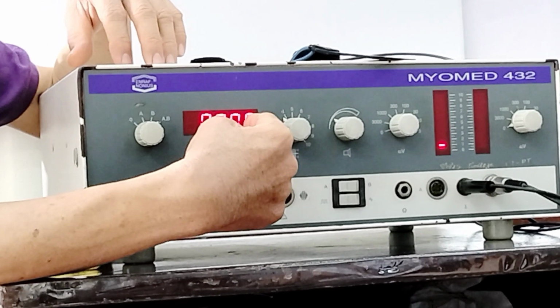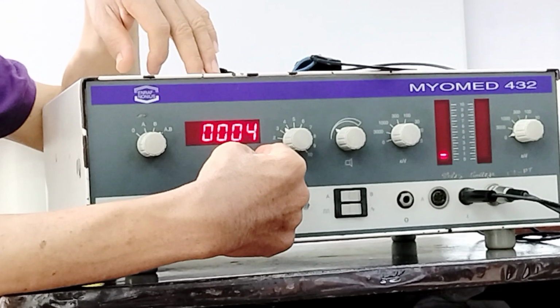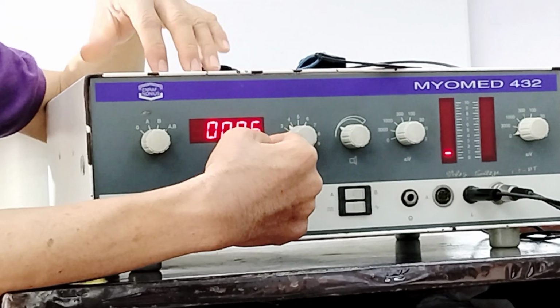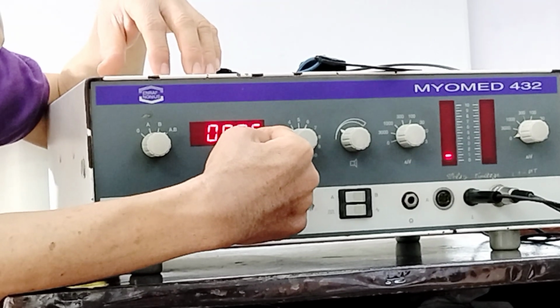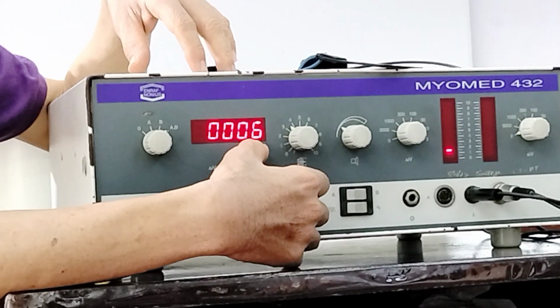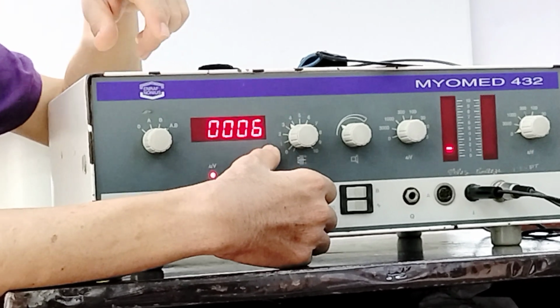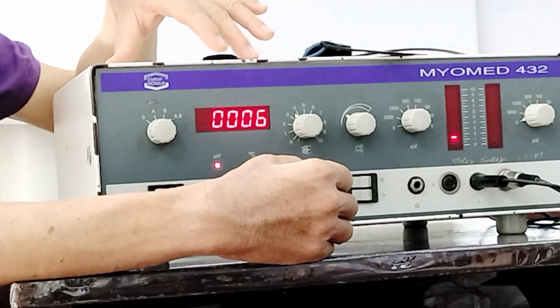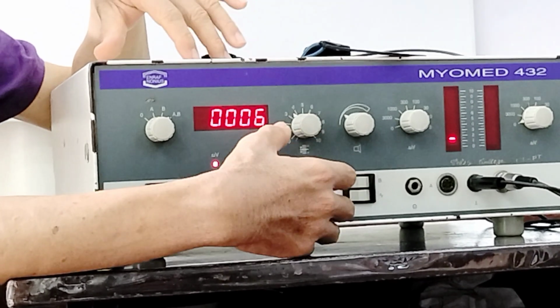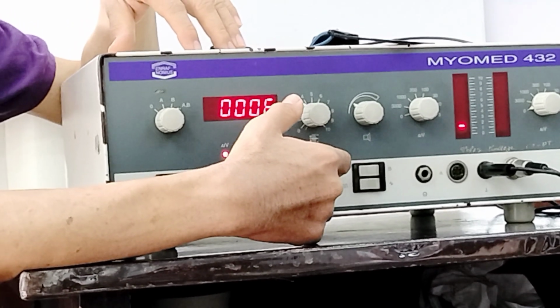By looking at the values there, the therapist can assess whether the condition of the patient is improving or not. Let's say, for example, today when doing the biofeedback, the patient is able to reach 5-6 microvolts. The following day, when the therapist again does the biofeedback training, the patient can now reach 12 or 15 microvolts. That would indicate improvement in the condition of the patient. Therefore, the therapist can assess using this modality.